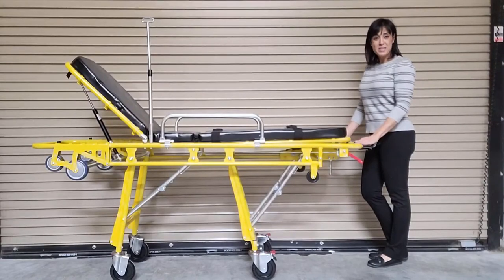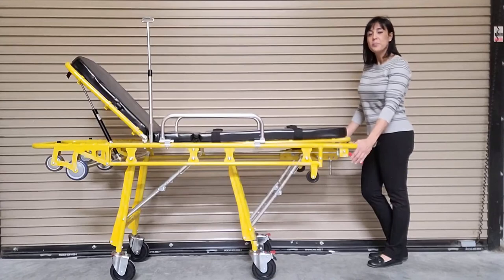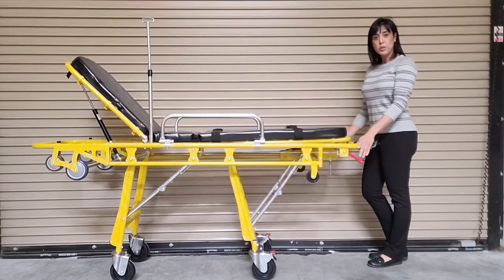The MS-3C-200C also has the ability to do Trendelenburg and Reverse Trendelenburg positions. To lower just the head end of the stretcher, squeeze the right handle at the foot end of the stretcher. To lower the foot end of the stretcher, squeeze the left handle at the foot end of the stretcher.